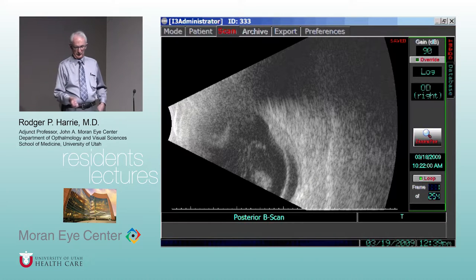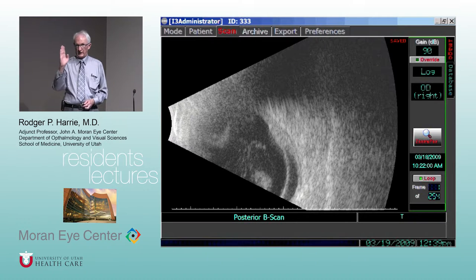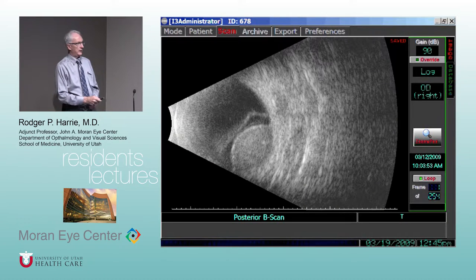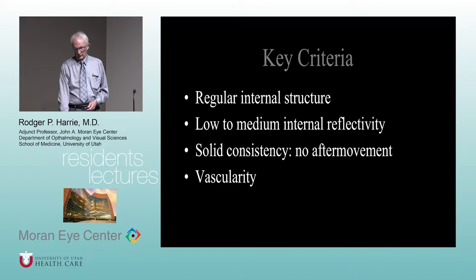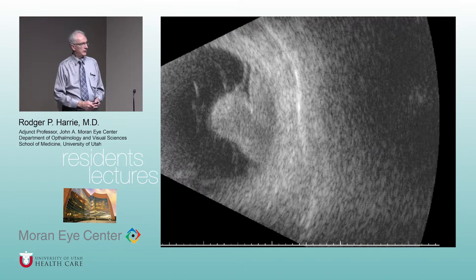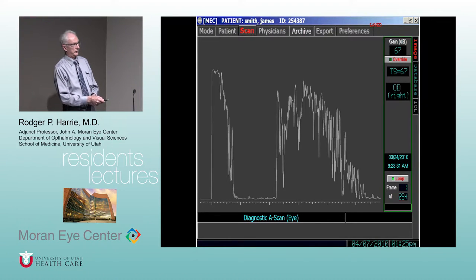Solid consistency - this tumor doesn't move. The retina over it is moving as the eye makes micro-saccadic movements, jiggling, but the tumor is solid. That's even more apparent on the A-scan - it's just a solid spike, it doesn't jiggle the way a membrane does. In another case showing a melanoma with retinal detachment over it, the retina was moving a lot while the tumor remained solid. Vascularity shows as little tiny vessels - like stars in the night, twinkling - inside the tumor. The A and B-scan can show that, and the A-scan shows little spikes moving, spontaneous and independent of eye motion.